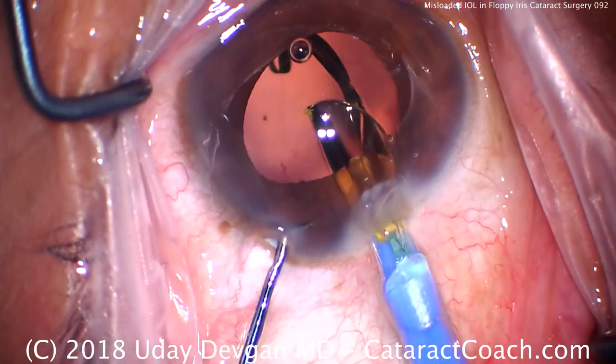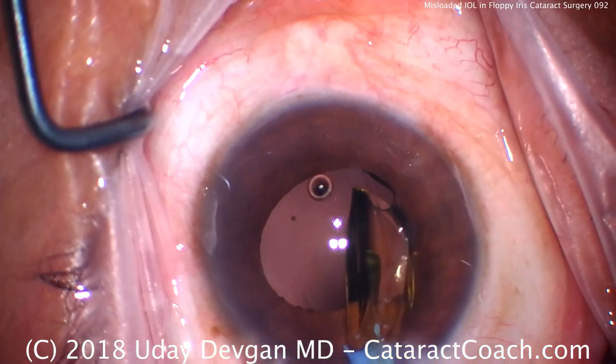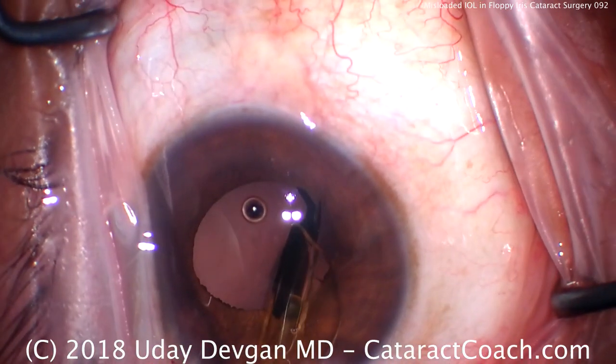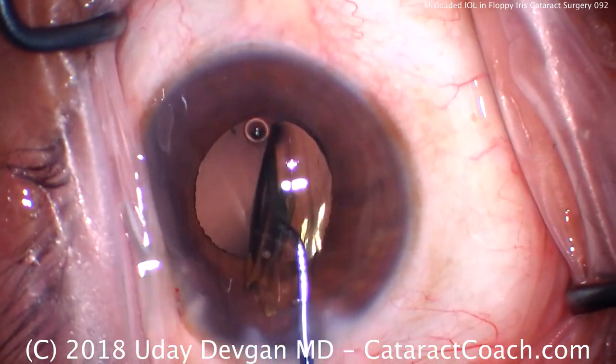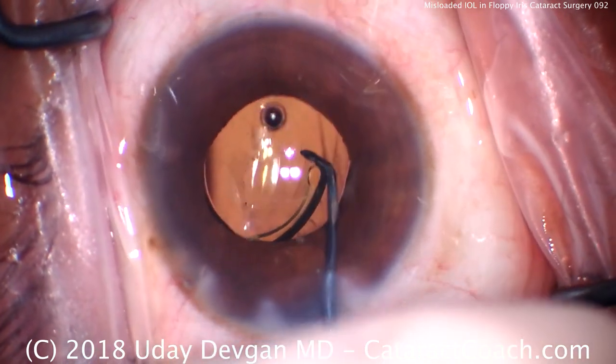We deliver that and use the chopper to get the haptic under the rhexis, then deliver the rest of the optic and the trailing haptic. We'll use our chopper to flip it over, again ensuring that the haptics are not in the S configuration.